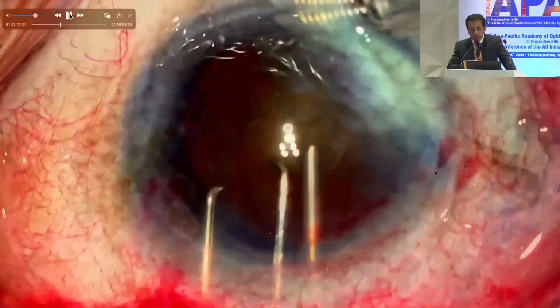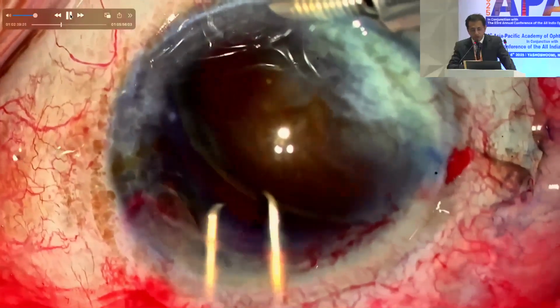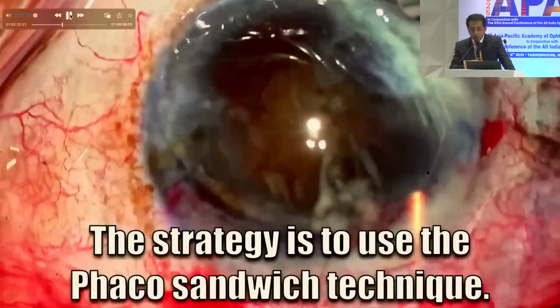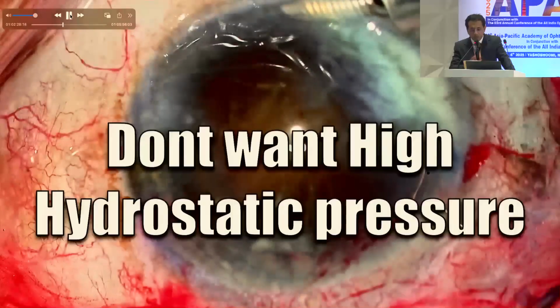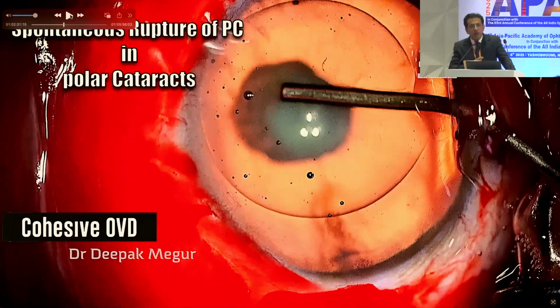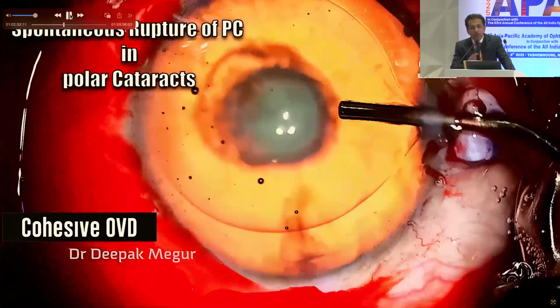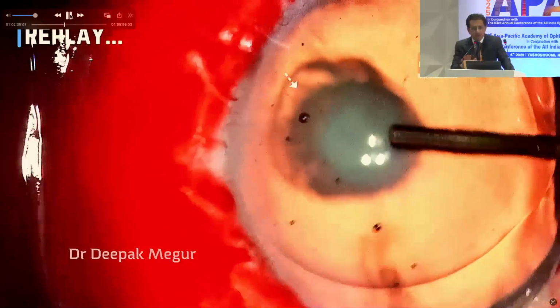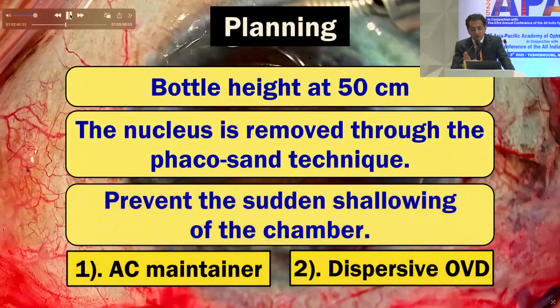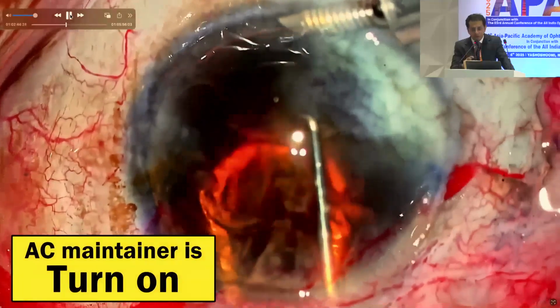I'm using it off late. I had never used an AC maintainer before, but of late I find it helpful. At this stage it is still off; it's not on now. It is turned on only when I'm removing the lens. Another point here is that we don't want a very high hydrostatic pressure. If you keep the bottle at 90 centimeters, you are going to blow out the capsule. The function of the AC maintainer at this stage is just to ensure that the chamber does not collapse, so it is kept at 40 or 50 centimeters. If you overfill, you are going to blow out the chamber. So the bottle is kept at 50 centimeters and it is on only at this stage, when you're trying to prolapse the nucleus out.